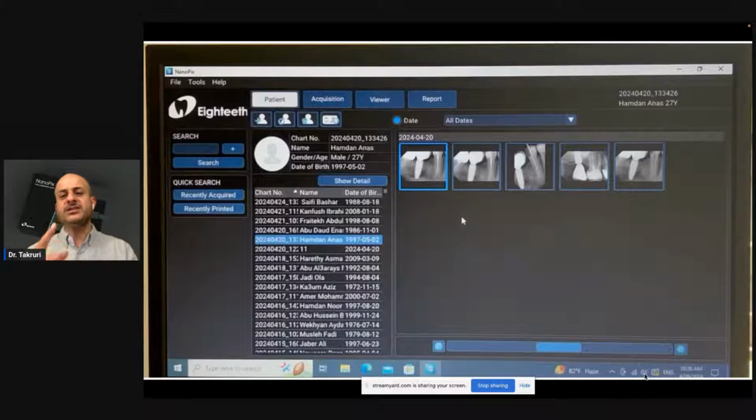Even if your patient refuses your treatment, they will go out with this amazing report that I will show you how to make, showing it around to relatives and maybe other dentists, and influence them with your report. Okay, look, this is a small video.